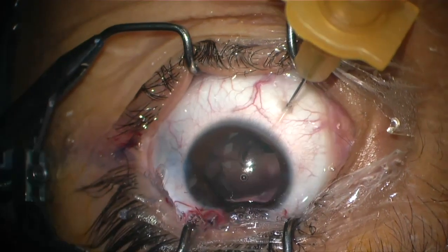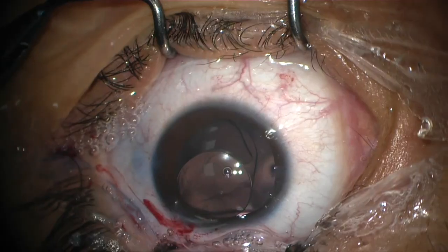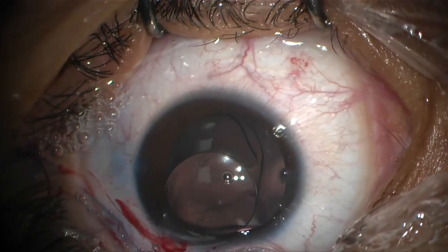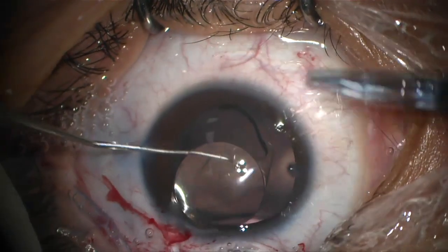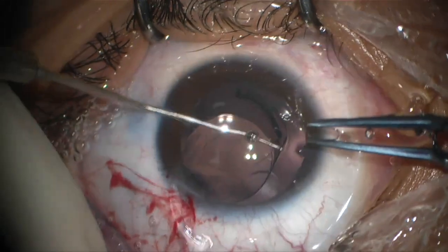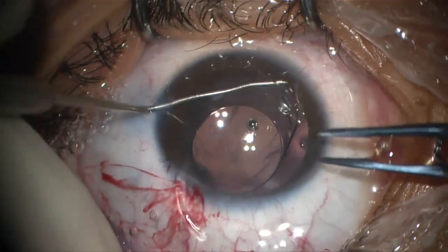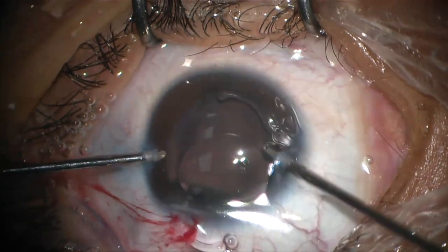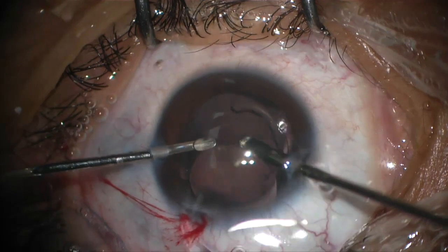Using a hook to manage the haptic and then forceps to secure it, we assess the situation — whether to place the IOL in the bag, in the sulcus, or to exchange it. Vitrectomy is performed to remove the vitreous prolapse.